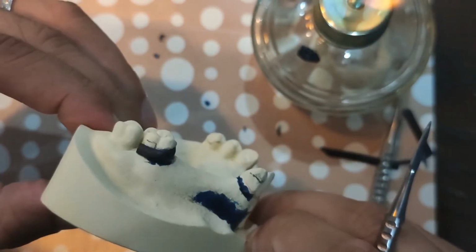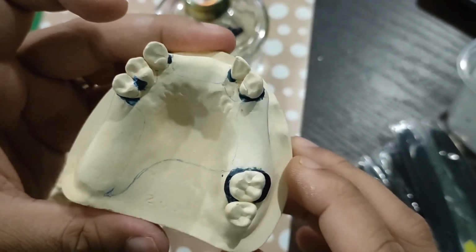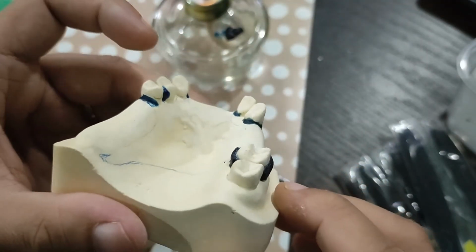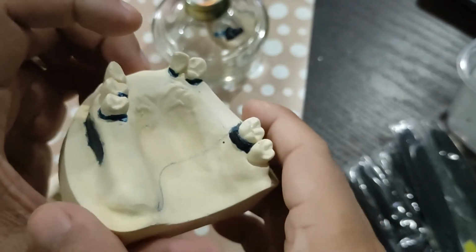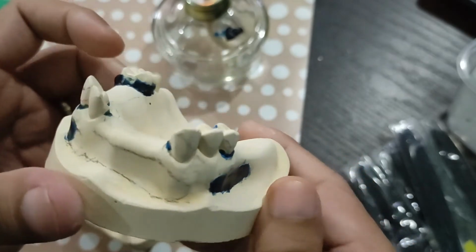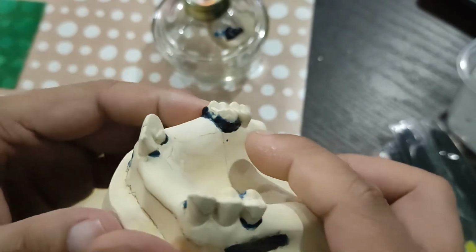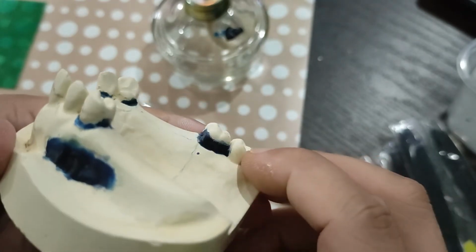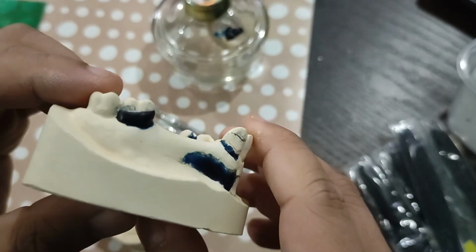I'm going to modify this a bit and I'll show you after. Okay, so this is the shape blockout done. Notice how thick the ledge is on all sides. Here. You see? The lingual is for the reciprocal arm. For the buccal, it's for the retentive arm.